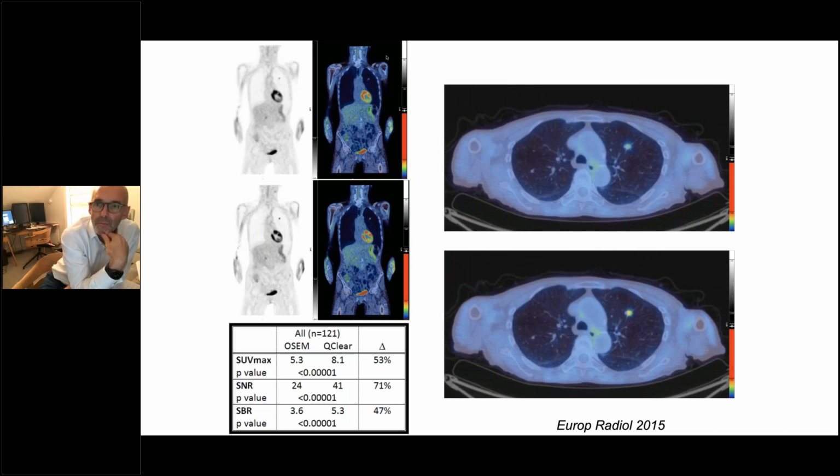And has the algorithm learned that avidity is related to malignancy and therefore it is more likely to suggest that it is a tumor? So when you are using your algorithms, whether they're technological or clinical, you need to know on what they were trained and on what they were validated. And it makes a huge difference.